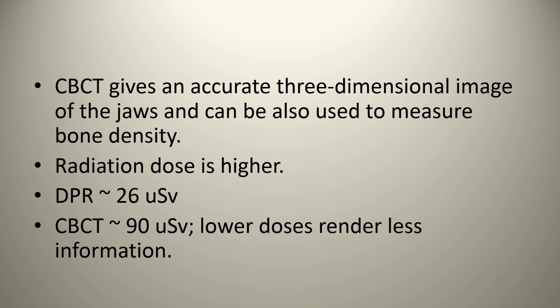However, as many of you who've been out there working in the world of digital imaging will realize, some digital radiographic equipment, things you can buy in various places, don't necessarily look as clear as, say, these nice panorexes that you see advertised at various conventions. So basically, unfortunately, in order to get more information, you have to give the patient a higher radiation dosage.